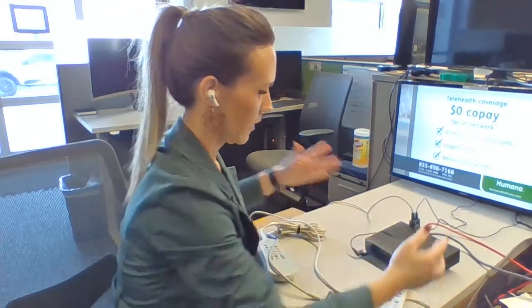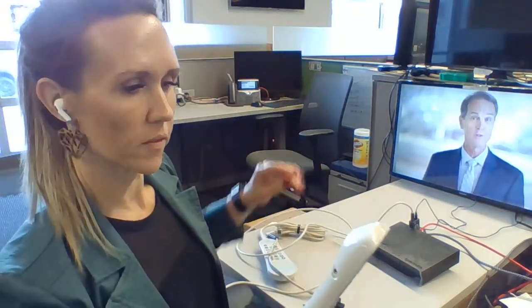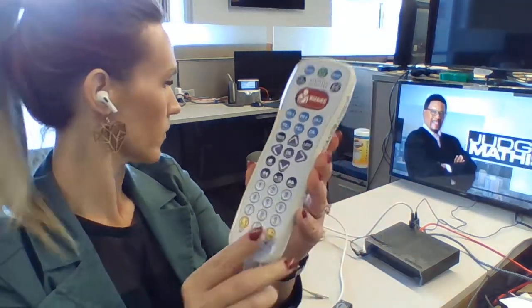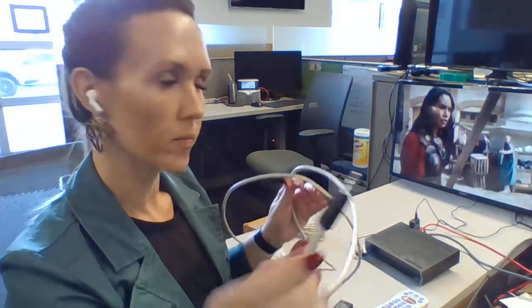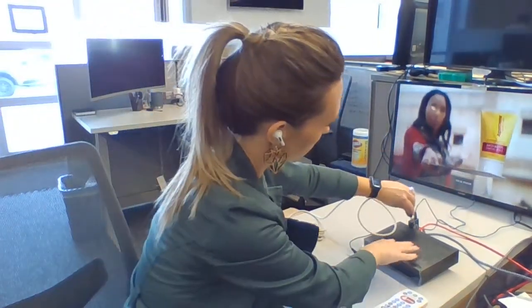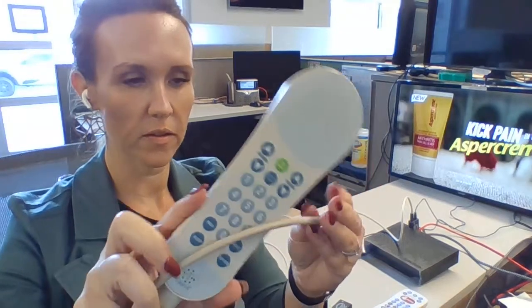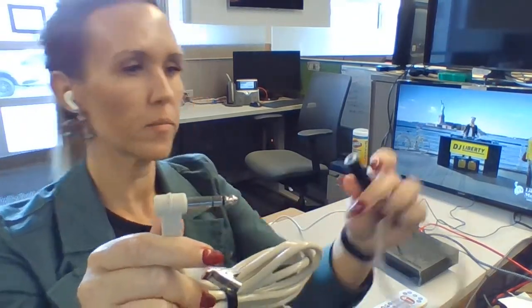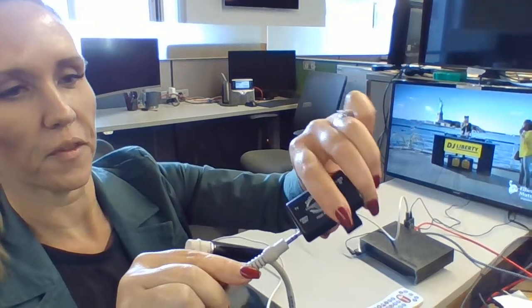Now that's plugged in and I have two different interfaces here. This one is the Anacom Medtech — this is what the end looks like. And then I have another model here that looks like this, which the end is a 4.5mm with this adapter that goes on here, which turns it into 3.5mm that will connect to this interface.